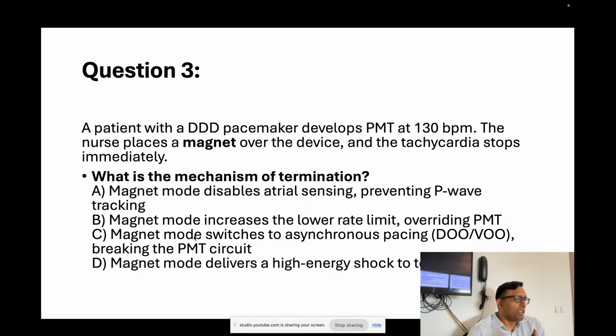And if you are having an iPhone 15 plus, they work very well, at least for the Medtronic devices. So when you put it, it will reset it. So that is so powerful, the magnet part is. If you are not getting a magnet, at least try with that one. It may help to reset the device. So magnet, I think some 20 Gauss magnet should be there, and it works on the reed switch. So the reed switch is going to just make it, you should not do anything, just pace. That is the thing, it is going to give the direction to the pacemaker.